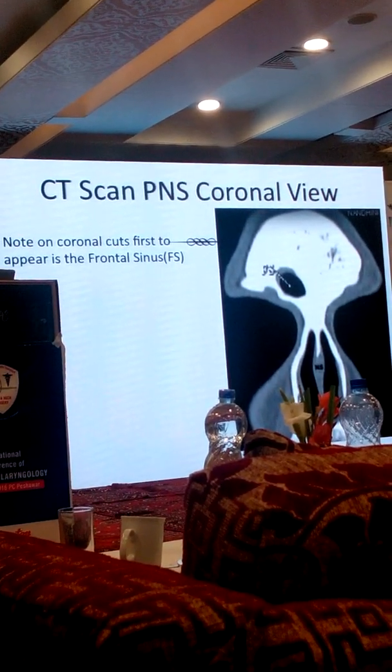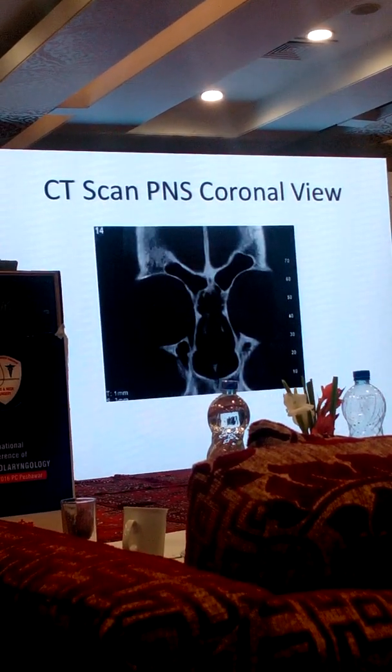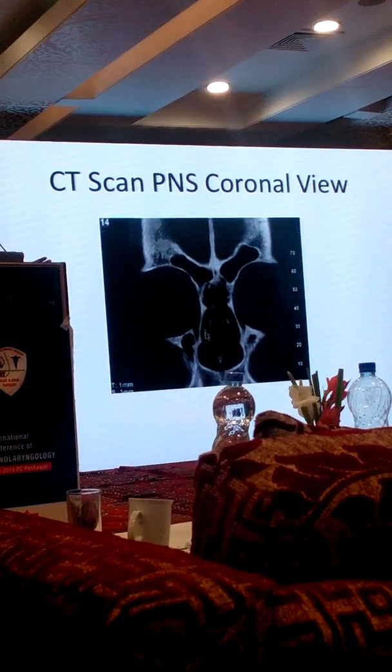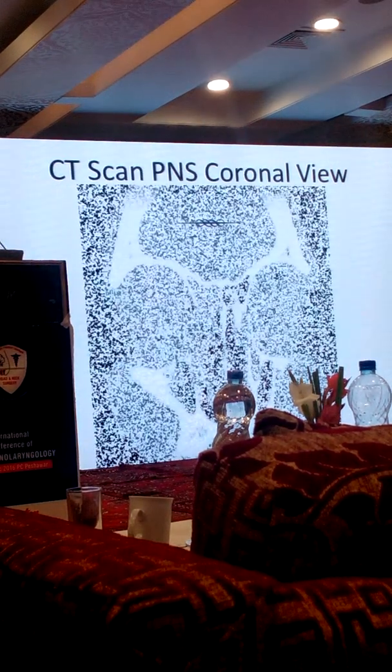This is the nasal bone. The infraturbinate is just making its appearance. As we go a little bit posteriorly, we can see the entire frontal sinus. Right? I will not go down yet. I am just talking about the frontal sinus, then we will go down again.